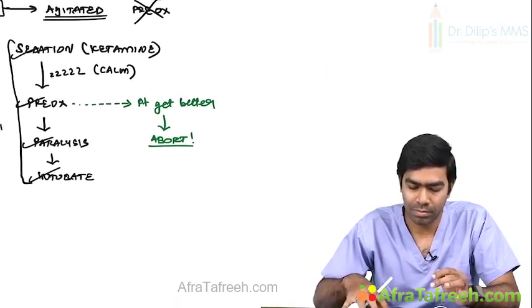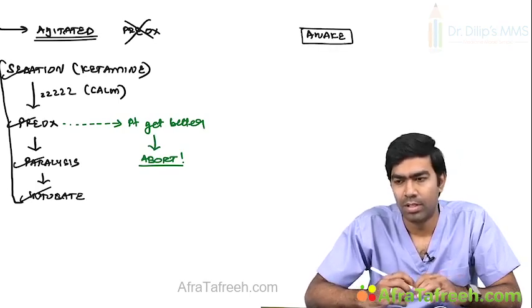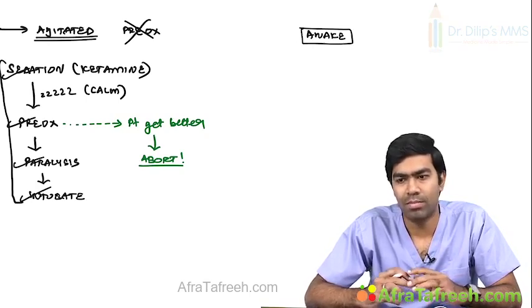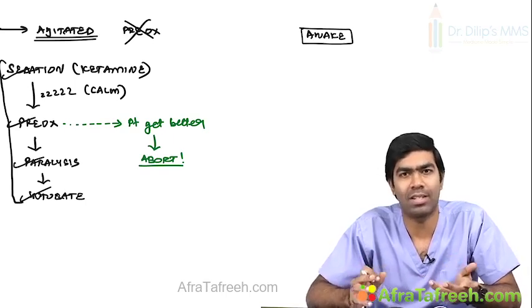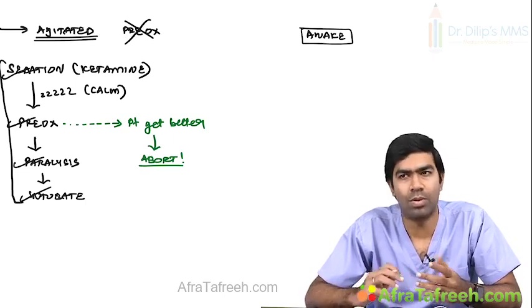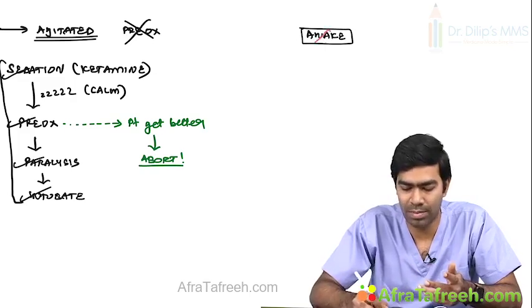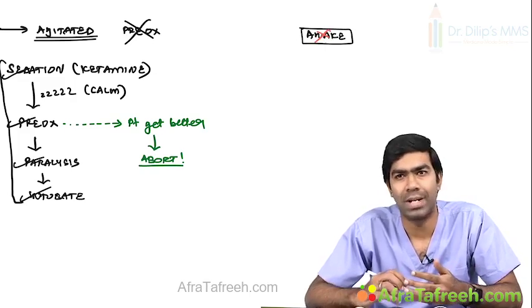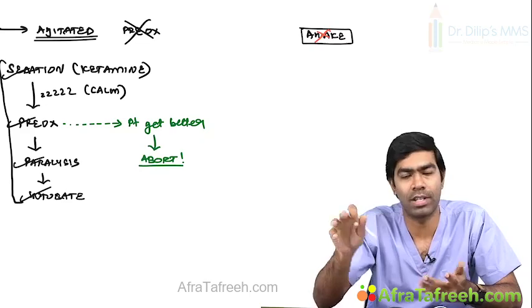Okay. The final sequence of intubation will be an awake sequence, or an awake intubation. This is not usually given in some books as a separate type of intubation, but still let us understand it as a particular sequence itself. So what is the real thing in awake intubation? Really, it's a misnomer. The name should not be called awake, because it falsely gives the idea that the patient will be awake and you are intubating them. No, it's not like that.